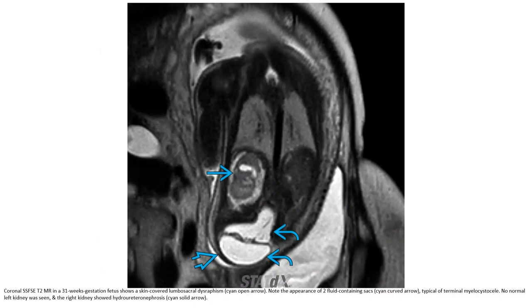SSFSE T2 MRI in a 31-week gestation fetus shows a sacral lumbar dysraphic defect. Note the appearance of two fluid-containing sacs, typical of a terminal myelocystocele. No normal left kidney was seen, and the right kidney showed hydroureteronephrosis.